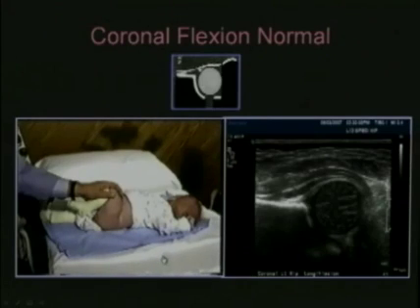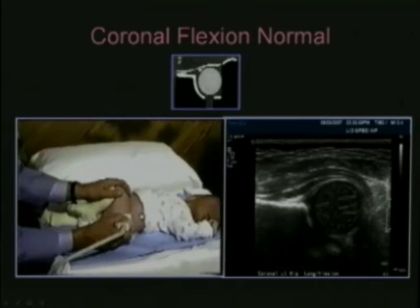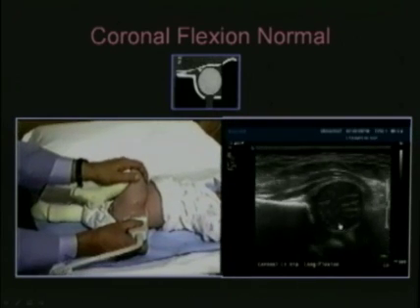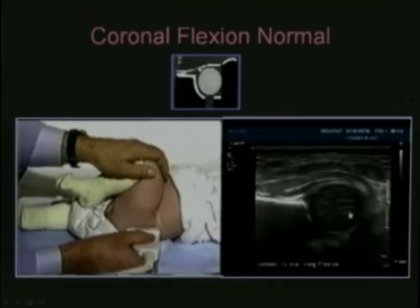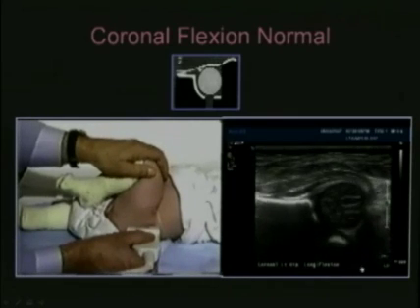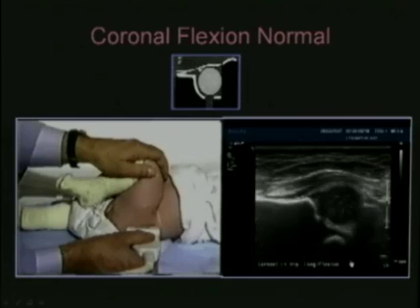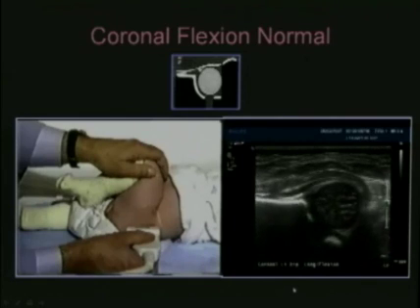With the hip and knee flexed, the probe is placed along the lateral aspect of the hip. We look for detail of the femoral head and observe that when pressure is exerted on it, it may show some motion out of the socket, but not more than 50%. With external rotation and abduction, the head returns to its starting position.